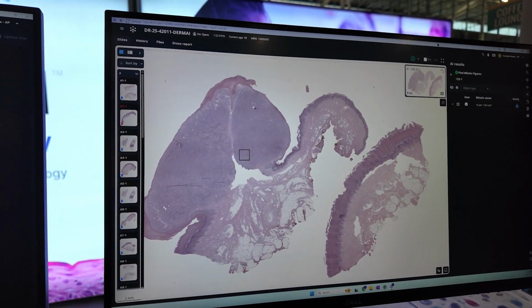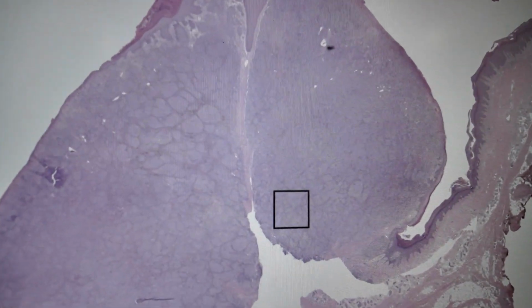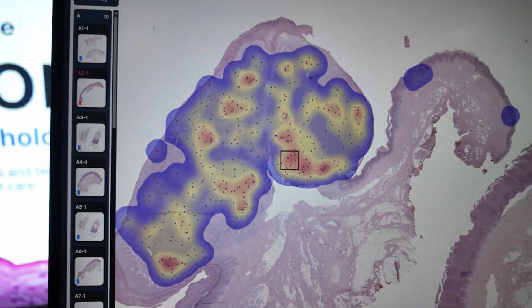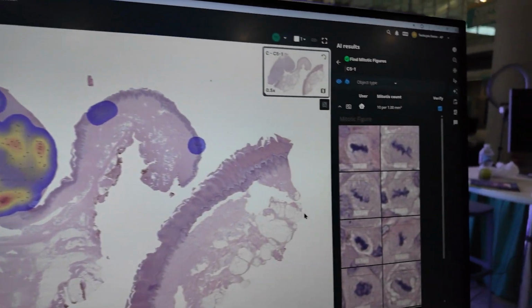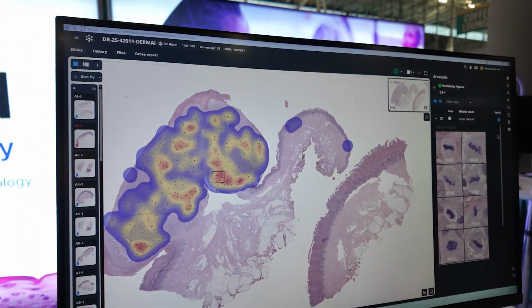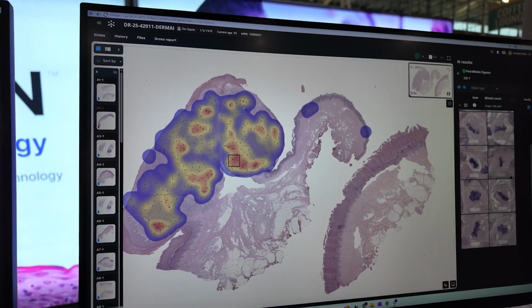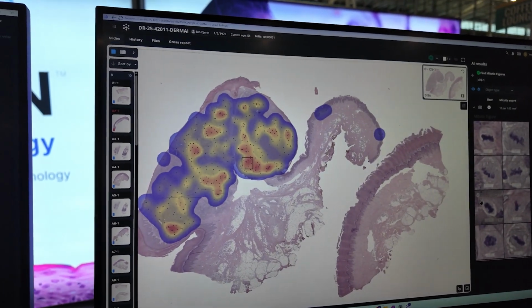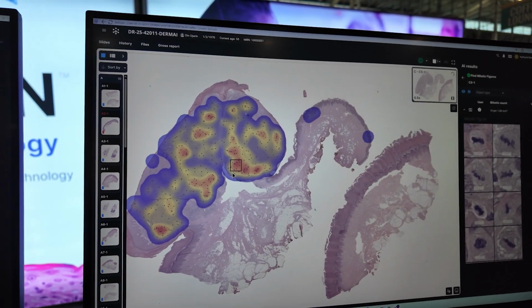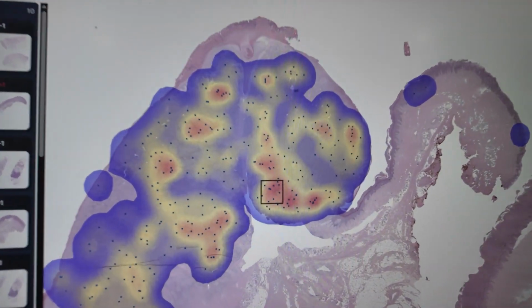So this one drops a hotspot annotation for a 1 millimeter squared area. Is this like the requirement? Yes, it's already integrated. It knows how big. We know for melanoma we want a 1 millimeter squared area to do the count, and then the AI does the count. The AI picks it based off of the model that we've trained, so it's able to find the highest density region. So it's a hotspot. We have the heat map to give you a visual indicator of the hotspot.